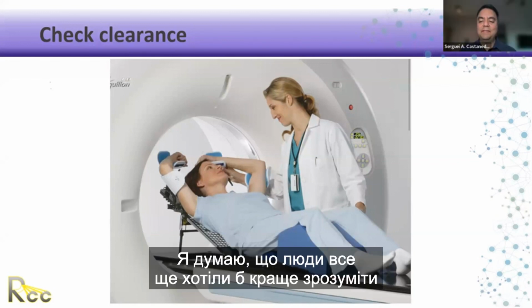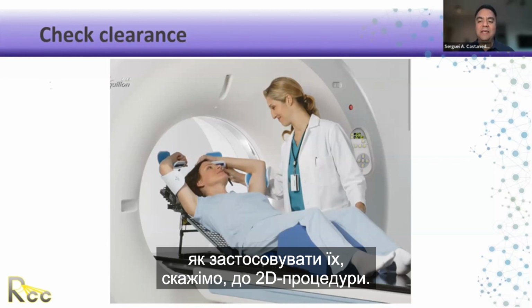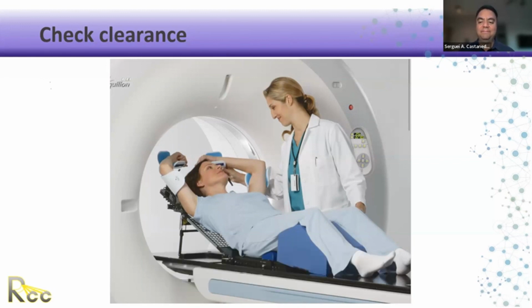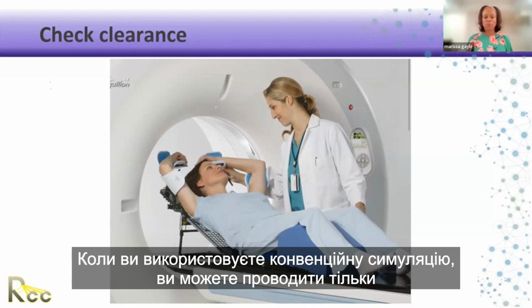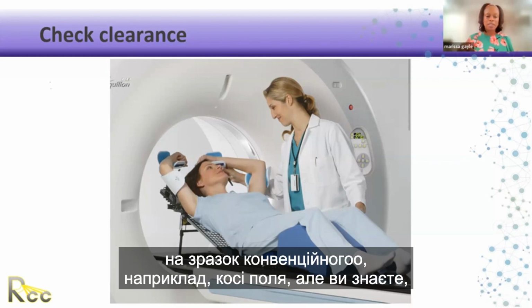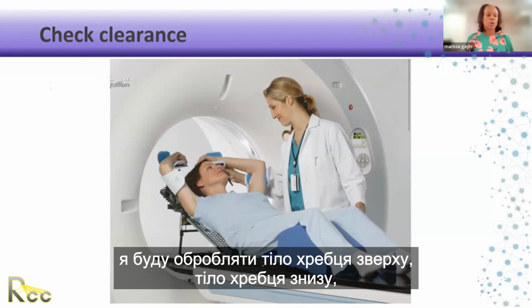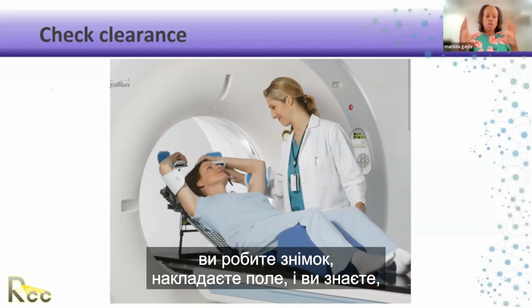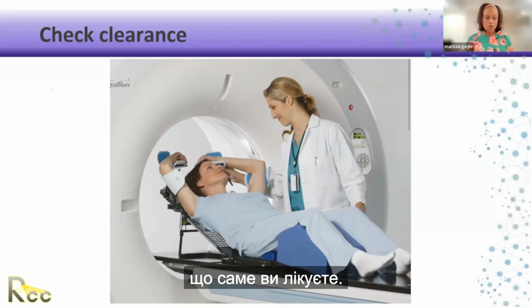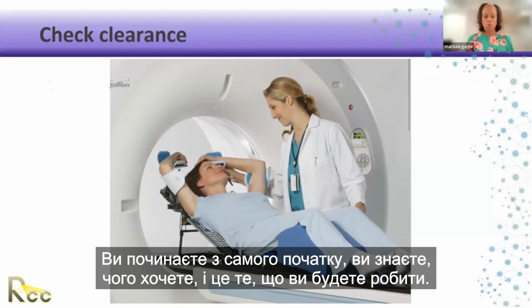I think people still would like to get a better difference between forward planning, inverse planning, and how to apply it to, let's say, a 2D treatment. Well, when you have a conventional SIM, you can only do a 2D or 3D treatment, meaning you're going to do something that's AP/PA or simple post, like oblique fields, but you know what you're treating. For example, if you're treating a spine, say I'm treating T8, I'm going to treat a vertebral body above and a vertebral body below. You take an image, you put the field on, you know that's what you're treating. So that will be forward planning. You start at the beginning, you know what you want, that's what you're going to do.